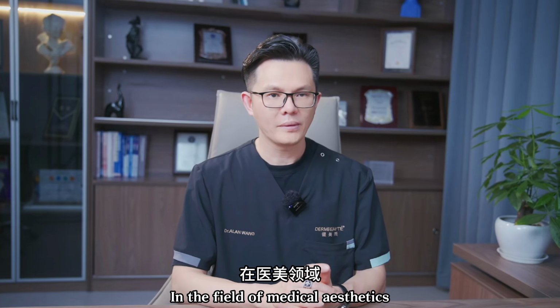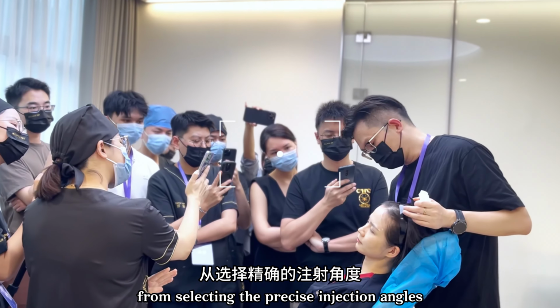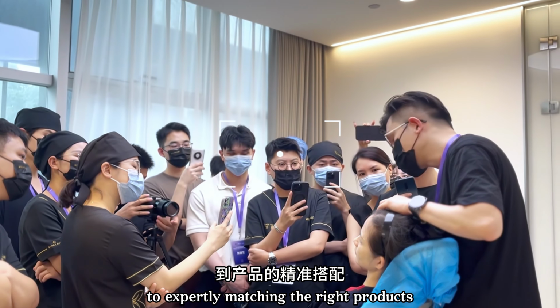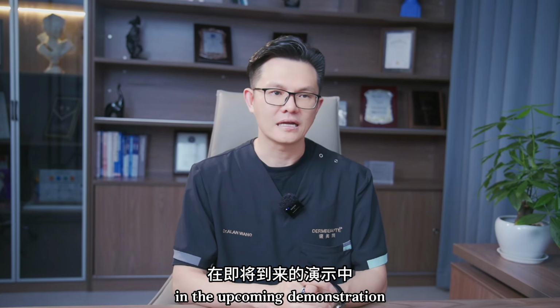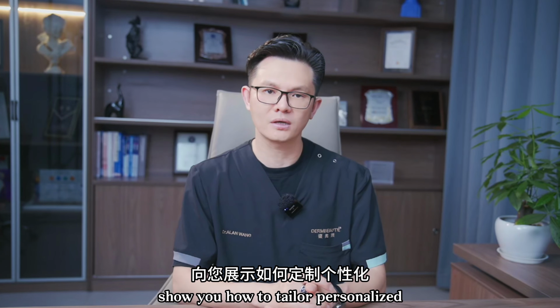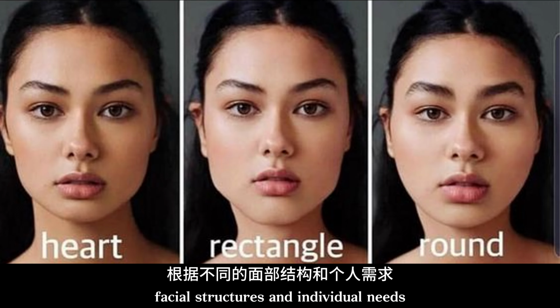In the field of medical aesthetics, the details make all the difference. From selecting the precise injection angles to expertly matching the right products, every step is crucial. In the upcoming demonstration, I will share my exclusive techniques and show you how to tailor personalized injection plans based on different facial structures and individual needs.